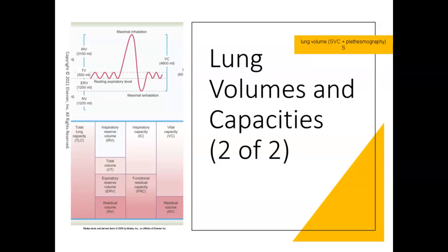And then I'm going to do my pre-spirometry, or pre-FVC. Okay. Then I'm usually going to give my albuterol. I give my albuterol then because I can do my DLCO. DLCO usually isn't affected by a bronchodilator. So while I'm waiting for that bronchodilator to work, I get my DLCO squeezed in, and then I finish with my post bronchodilator. So this is typically how I've always done my PFT testing.